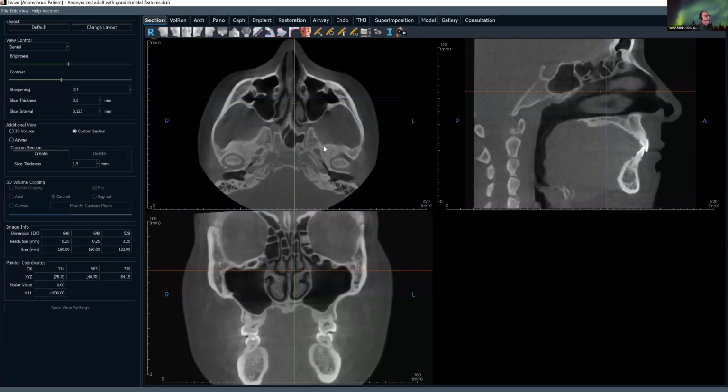Now, the Vidian canal is often very, very difficult to see, and this is pretty well demonstrated in here. So this is Vidian canal. And again, these rotundum and Vidian are leaving the sphenoid bone, traveling in that space, the pterygomaxillary fossa, between the sphenoid bone and the posterior aspect of the maxillary bone.